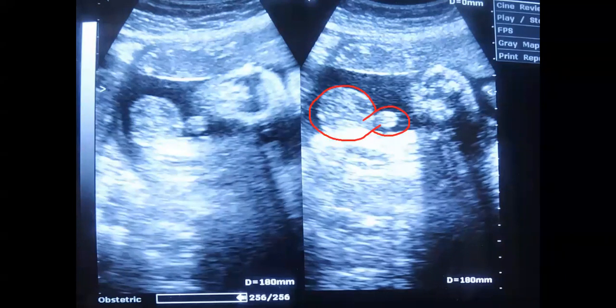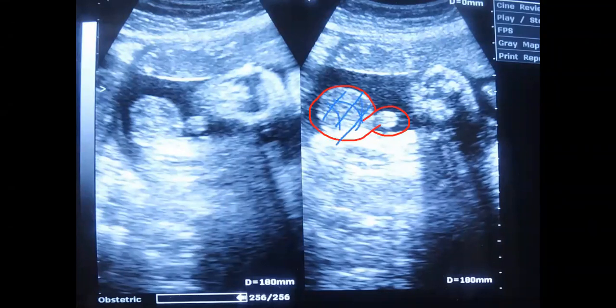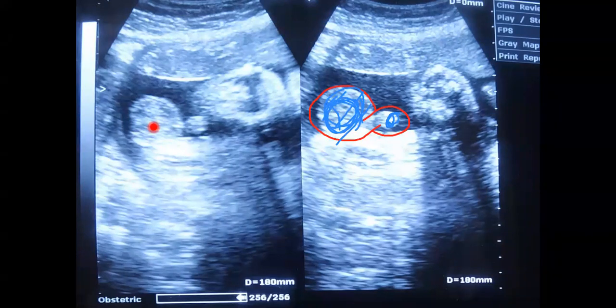Actually, this part is the testis — the scrotum. This is the scrotum of the fetus. And this protruded part is the penis of the fetus. On the left image, the same: this is the scrotum of the fetus, and this is the penis of the fetus.